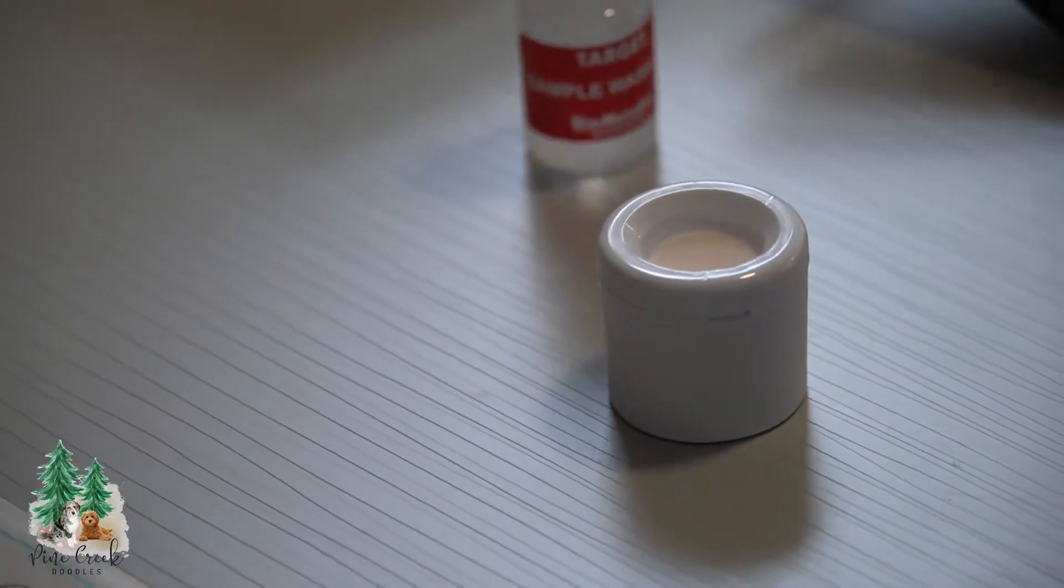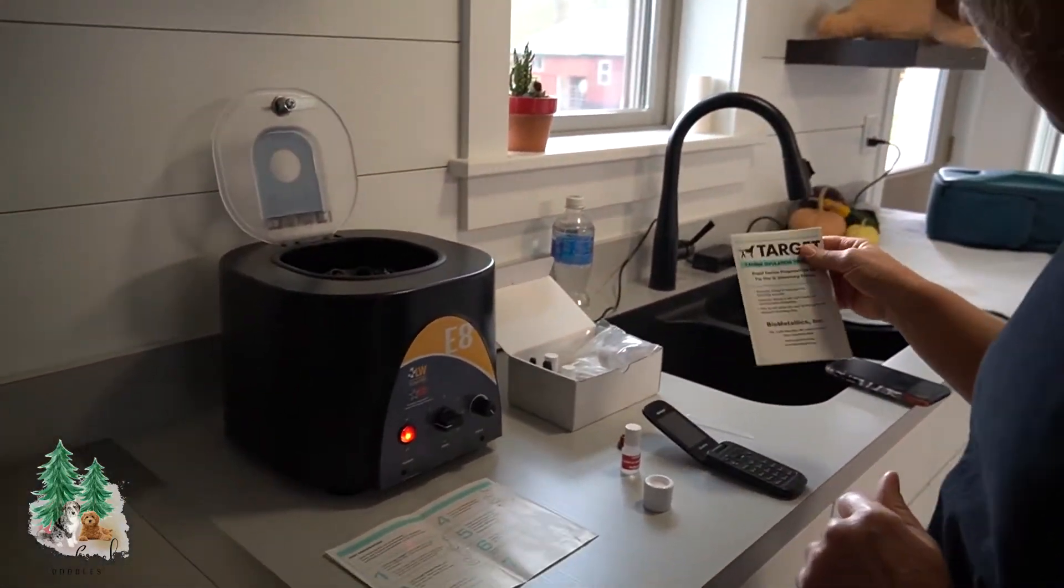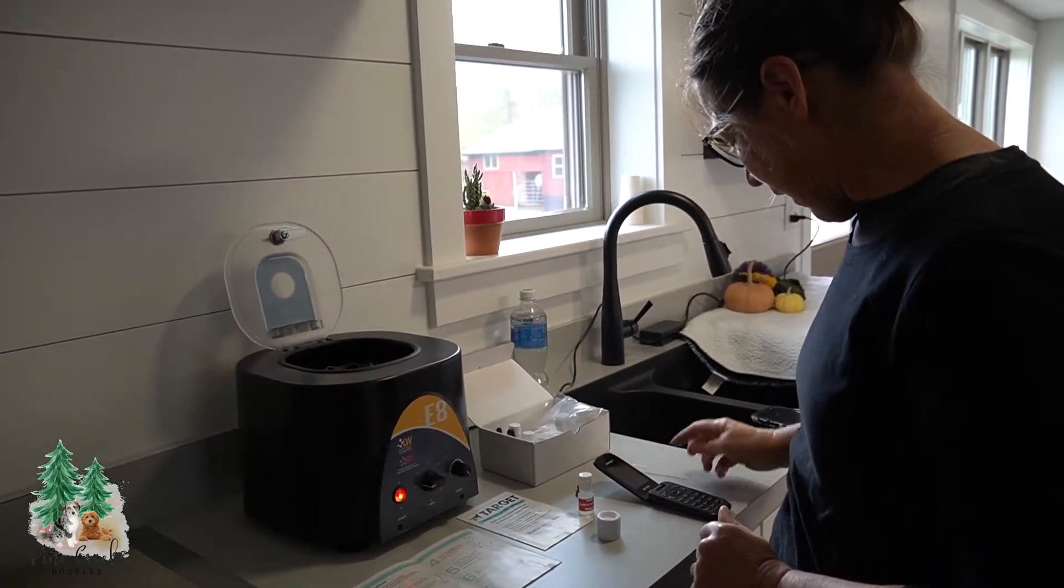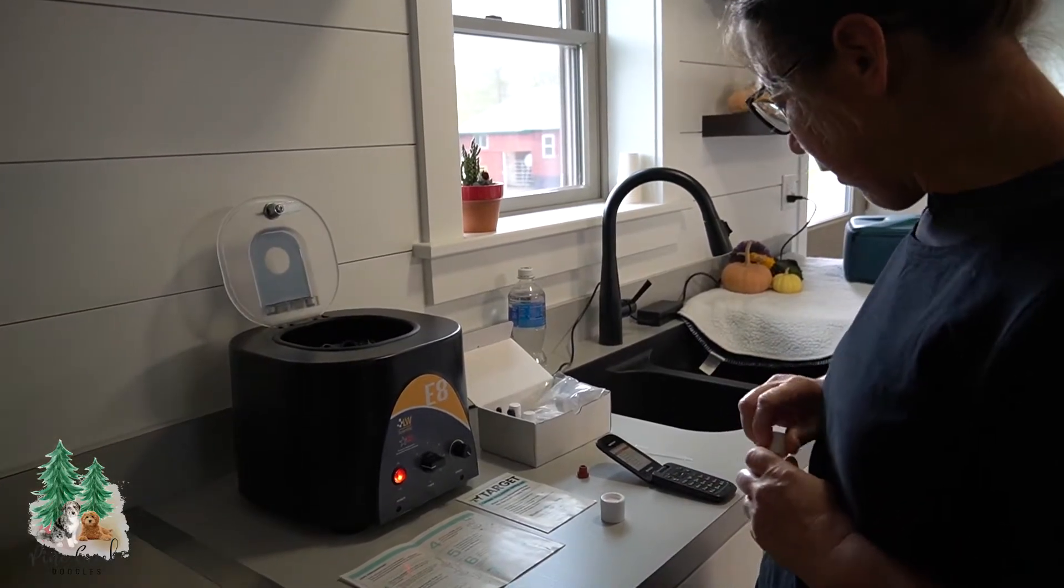This whole thing takes about, oh, usually 10 minutes to do the whole thing. We'll be able to see where Amber is going in her heat cycle here. So in about a minute, we'll drop off here.